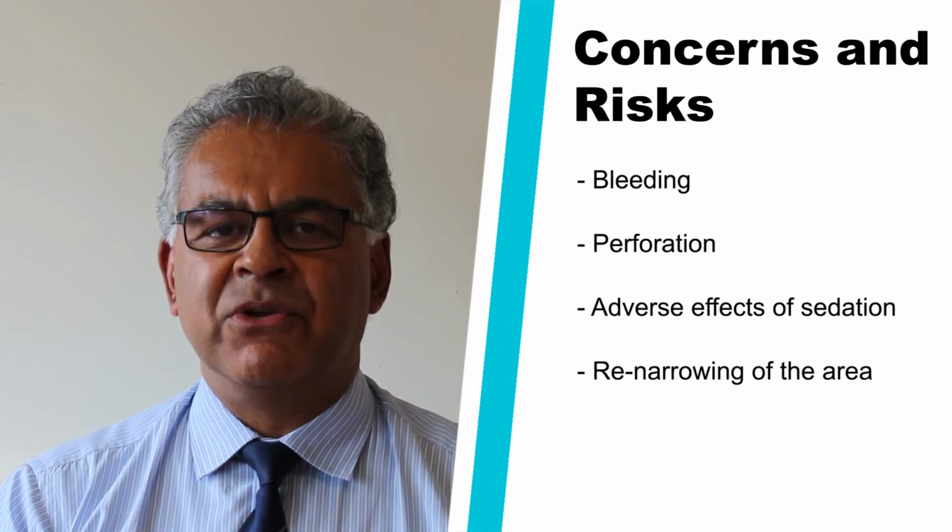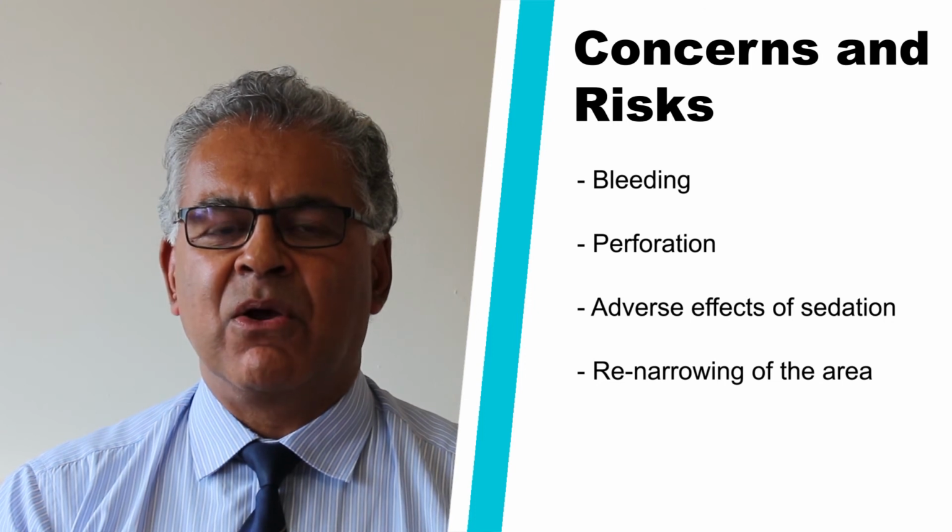One of the other issues that can occur with colonic dilatation is that the stricture reforms and the patient requires further dilatations in the future.